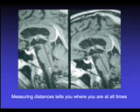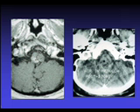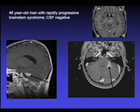As one then enters the medulla, we are clear as to where we are at all times, mathematically knowing at which point we enter the top of the midbrain and at which point we enter the medulla itself. On the right, one can see a small dot of air within the target after the biopsy, confirming accuracy of the sample. This is a 46-year-old patient with a brainstem syndrome and contrast enhancement within the middle cerebellar peduncle.